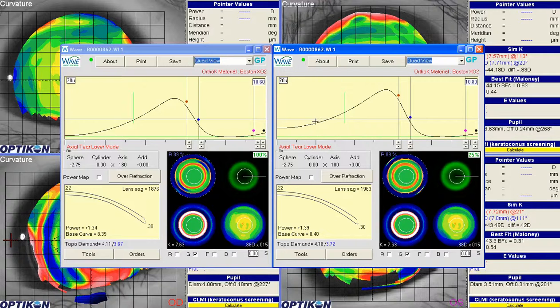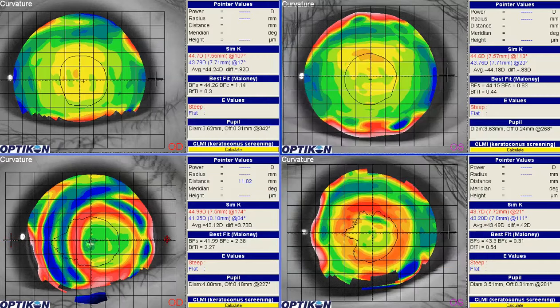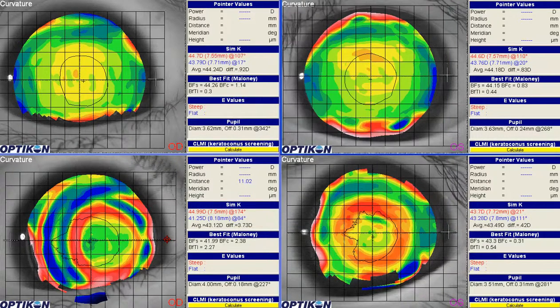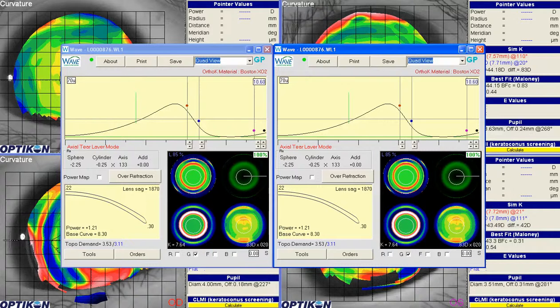So that should take care of the right eye, and then I'll bring up the lenses for the left eye. Okay, lens for the left eye. This is the one where the treatment zone looks fairly centered, but we do have residual myopia. So I'm going to increase this. I'm going to add a diopter into there for a target of plus 2.2. I'm going to do this in 100% mode.